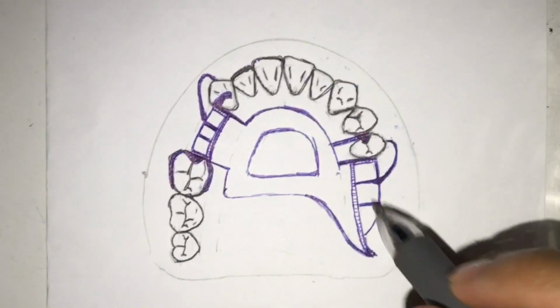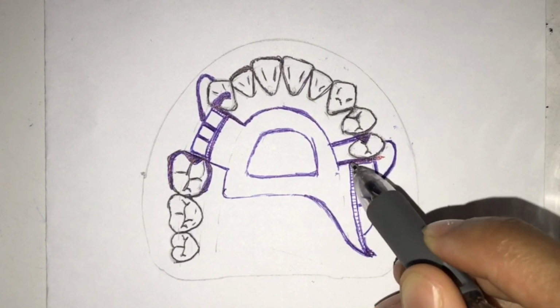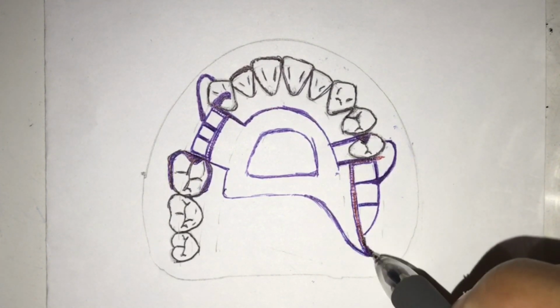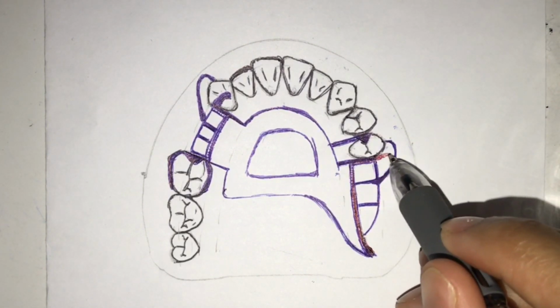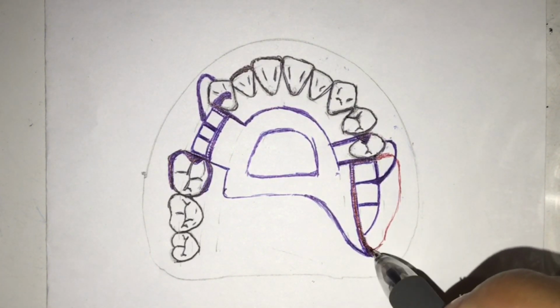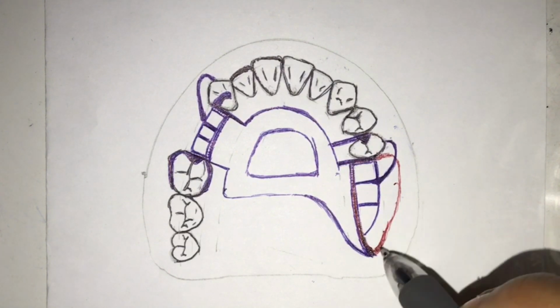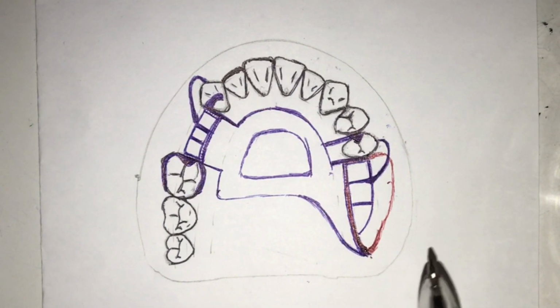It's because when you're going to place your denture base, you need to cover until your maxillary tuberosity for you to have what? The stability and the denture bearing property in maximum usage. Yes, you need to have it until here. And if you need to place your denture base until there, of course, the butt joint should end until there. Okay.